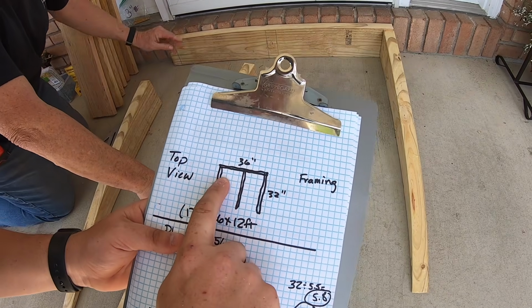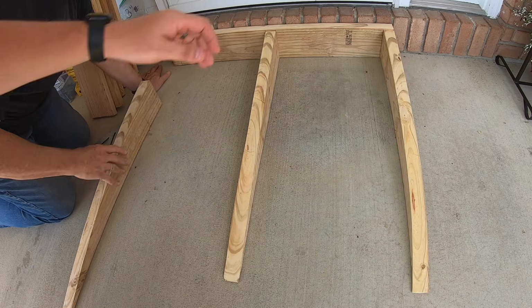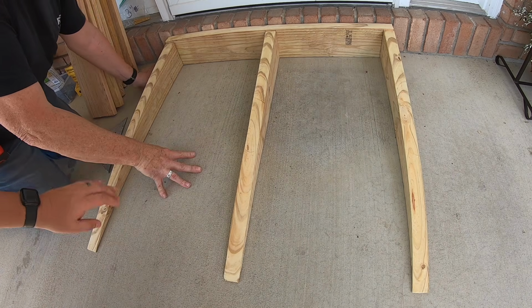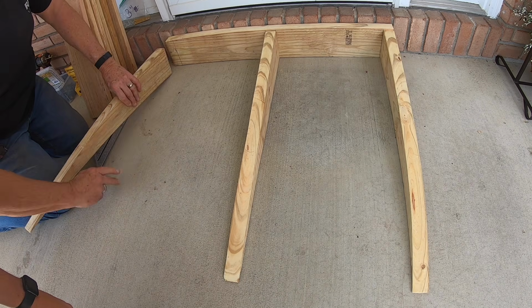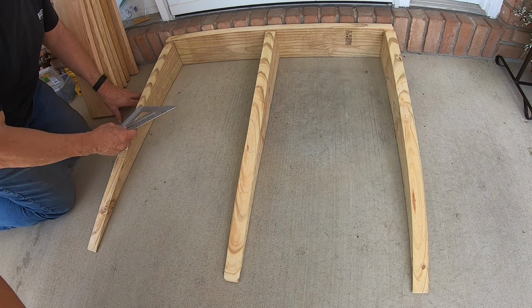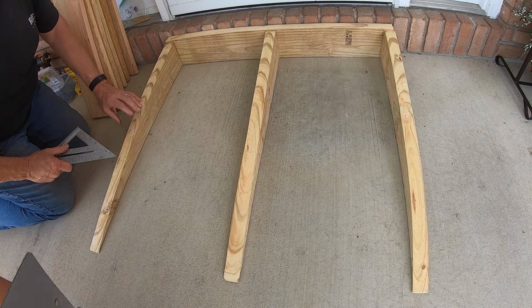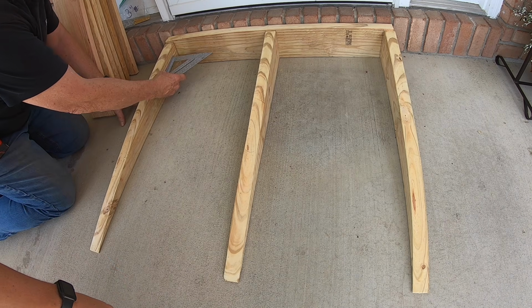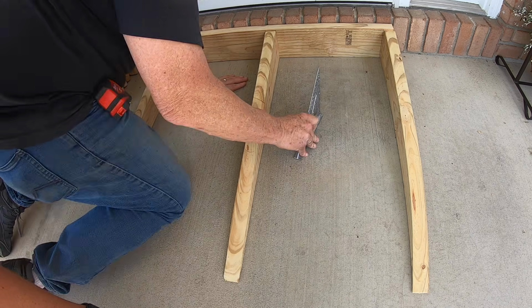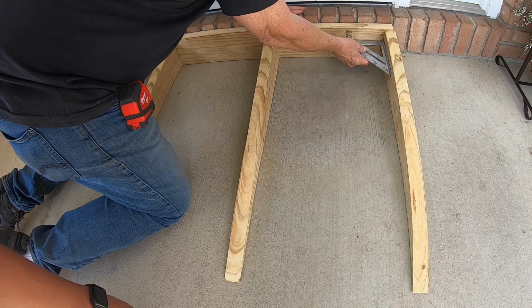So we're gonna go ahead and test to make sure this all fits correctly against the headboard. Each one of them has been pre-marked with a pencil, and this is exactly what it should look like. That gives you a good idea that you are squared up. Now remember, we are not bolting this down. This is a very temporary thing. The homeowner did not want us to bolt it down, just wanted something to easily get a wheelchair up and down for a short period of time. You are gonna make sure everything is squared up perfectly, so your square really helps with that. And you can go ahead and test all of it to make sure you are lined up and squared up just how you should be.